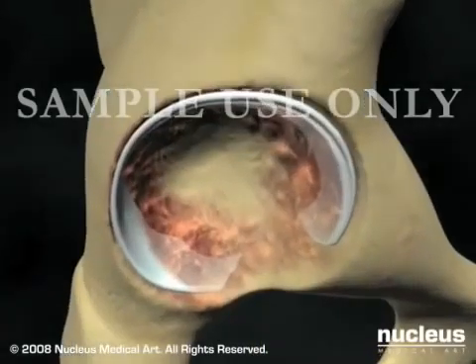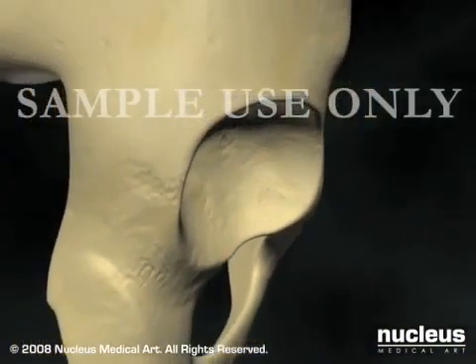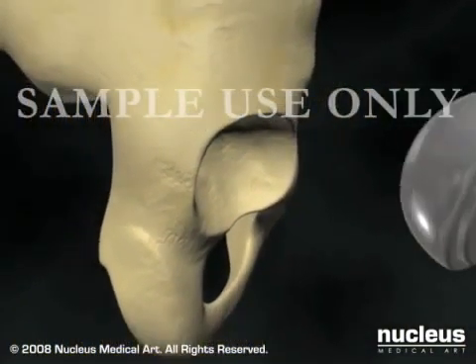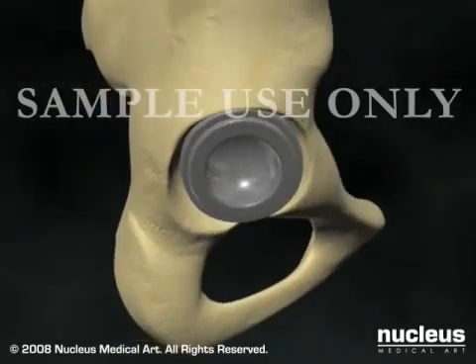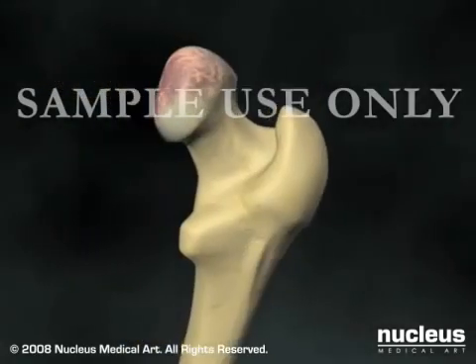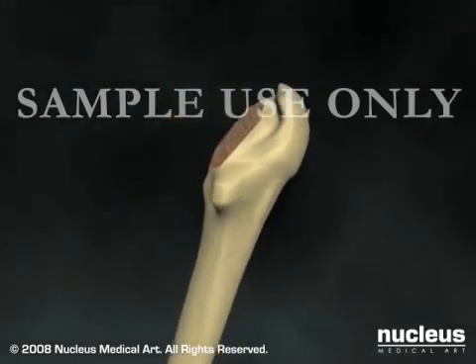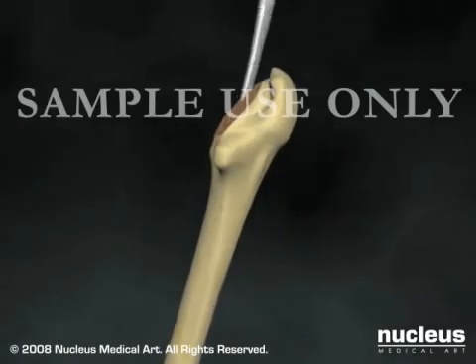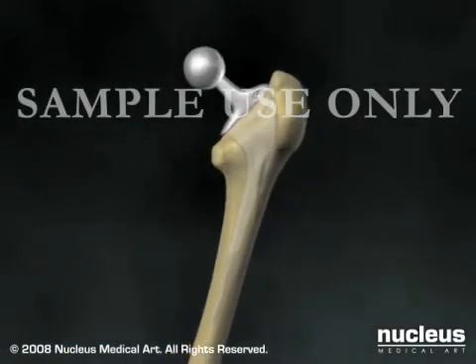He or she will remove any damaged cartilage or bone in the acetabulum, reshape the acetabular socket, and secure the acetabular prosthesis in place using special cement or screws. Turning next to the femur, your surgeon will remove the femoral head, shape the remaining femur to fit the prosthetic stem, and secure the femoral component using cement or other techniques.